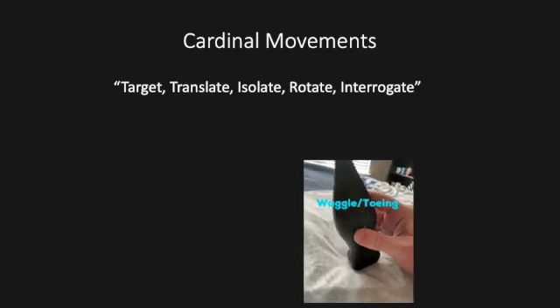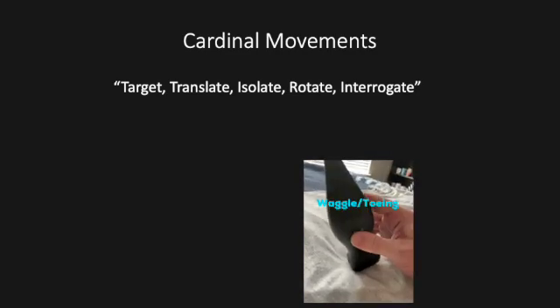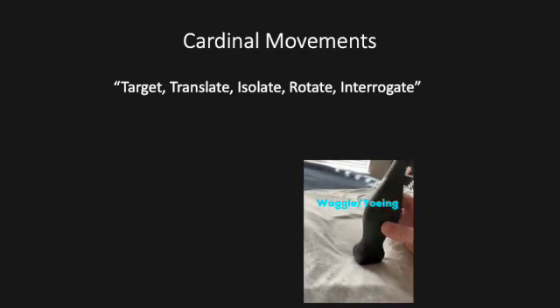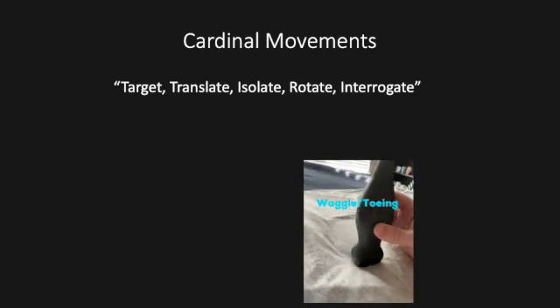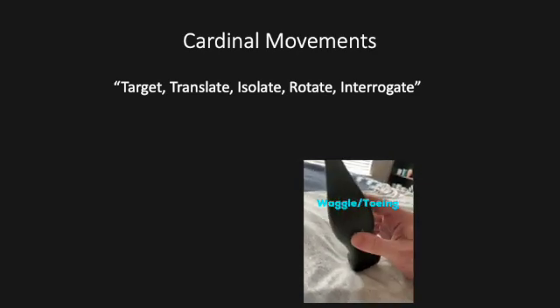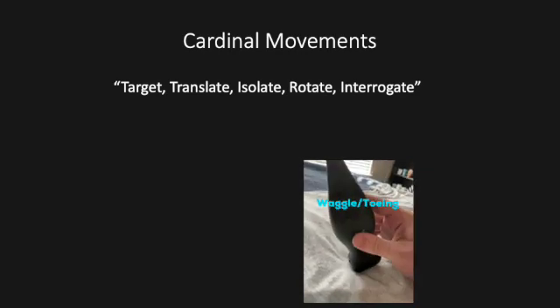Next, we'll talk about waggle or toeing. So I generally will say toeing. Every now and then you'll hear someone say rock the probe. But for me, rocking the probe, if you rock it left to right or up and down, they both mean different things. So I try to say toe in or toe out. Or if I do, I say rock the probe to the right or rock the probe to the left.